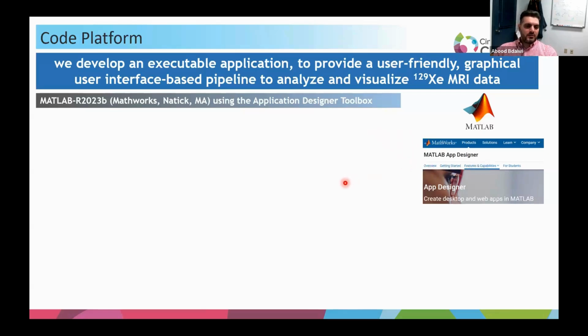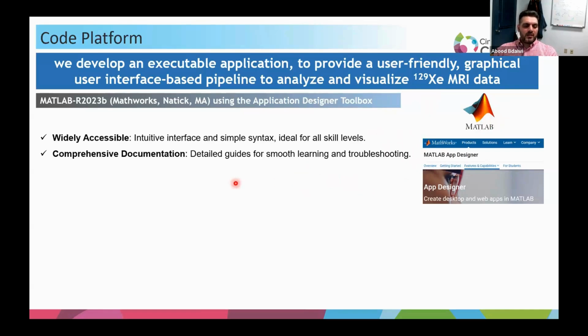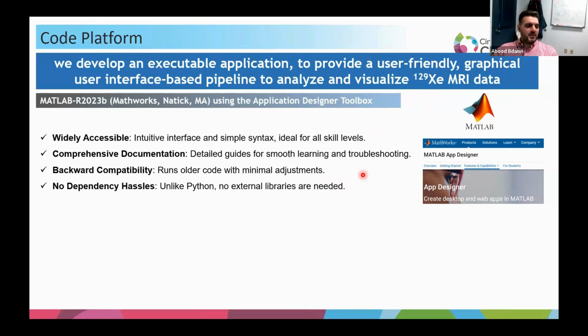So the toolbox was developed in MATLAB, specifically using the MATLAB App Designer. As opposed to Python, which is a great tool, open source and free to use, I chose MATLAB for different reasons. For example, it's widely accessible, it's a very easy language, if not the easiest language to learn. And they have tons of documentation and backward compatibility. So if you have a 10-year-old code, you can probably run it with minimal adjustment.